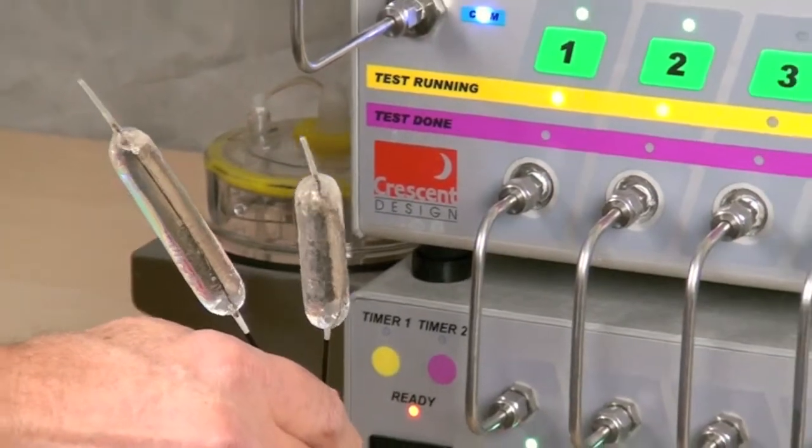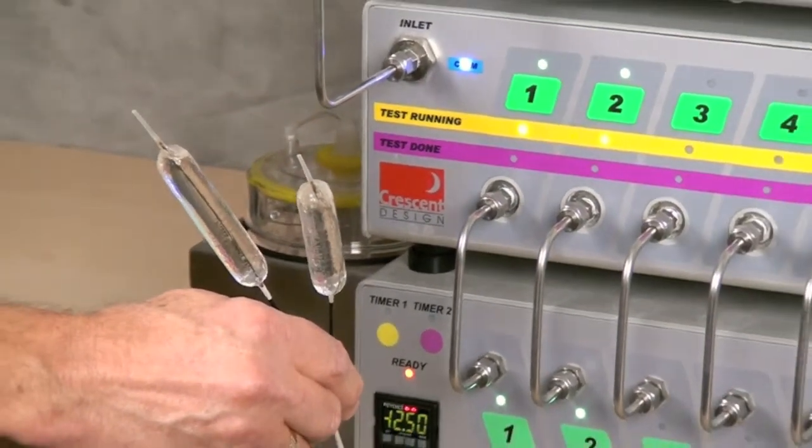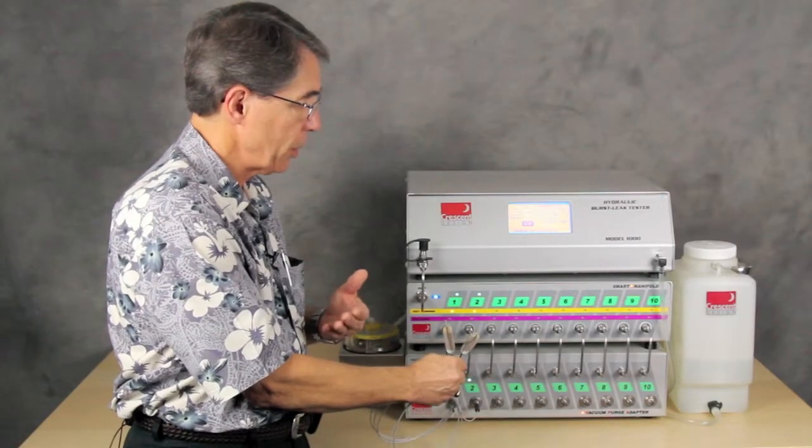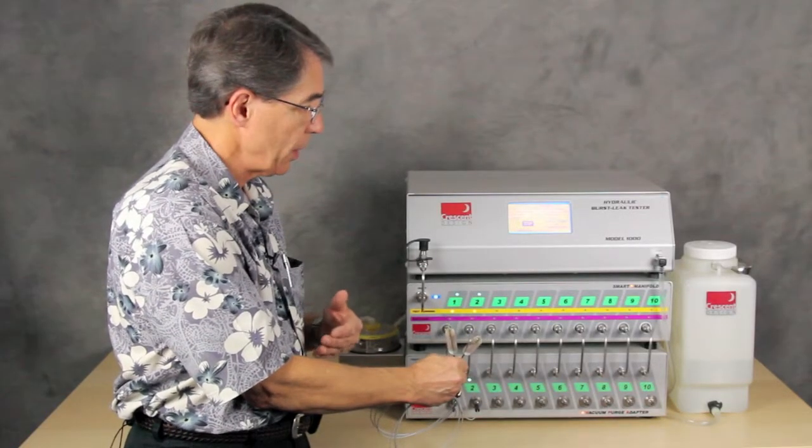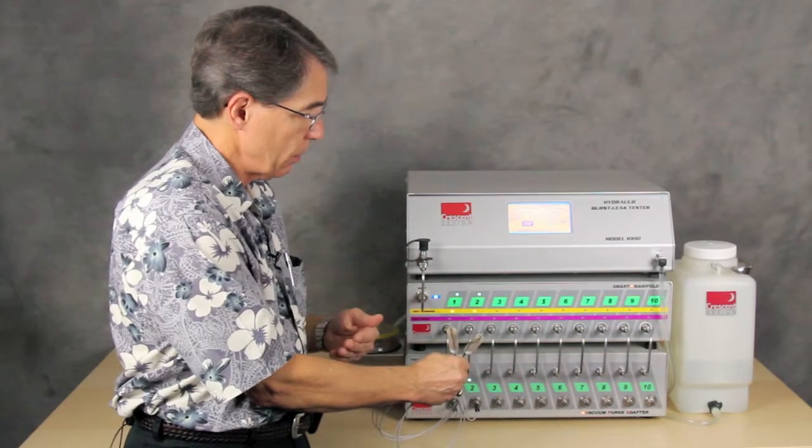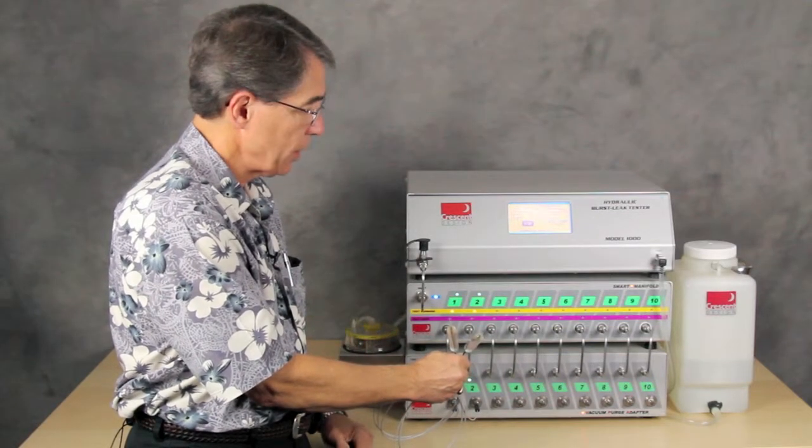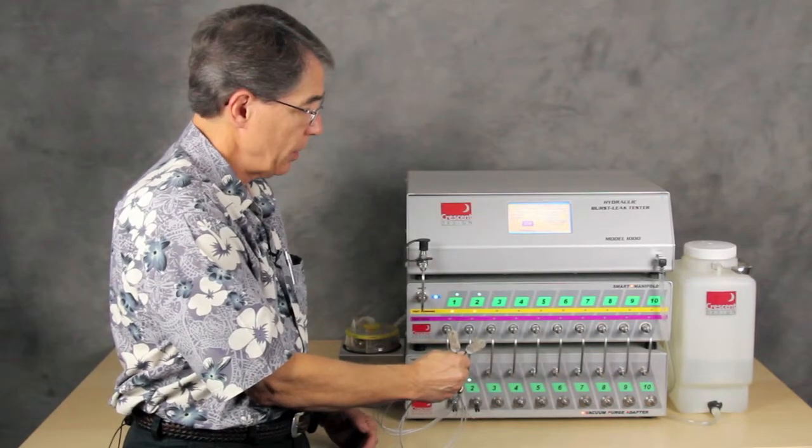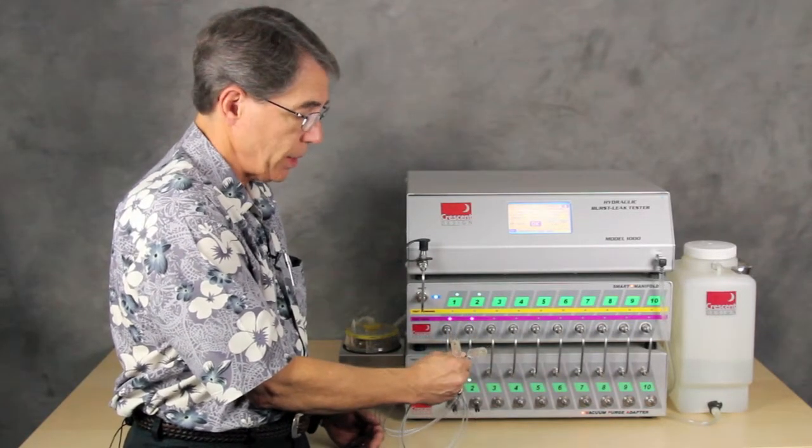So now the HBLT is resetting itself prior to the test. And now it's ramping to pressure. That's a very short test. It only goes to 15 PSI for a maximum of 4 seconds. And then it ramps back down to zero. It's down to zero. And the test is done.